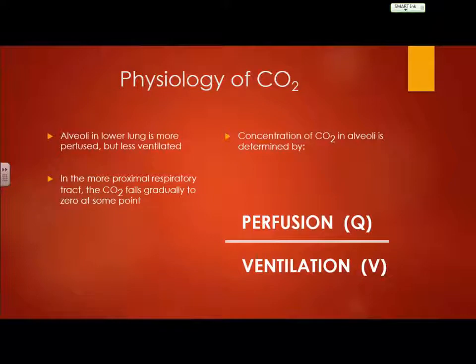Remember that? When you're breathing in, you've got around 150 milliliters of air that hangs out in that dead air space that you lose, and then you lose more of that pressure as you go down. In the more proximal respiratory tract, CO2 falls gradually to 0 at some point. We're measuring the CO2 as a whole, and if we were to measure the individual areas of the lungs, they may be a little bit different as we're expiring out. It doesn't really matter, though, because what we're doing is measuring it as a whole.